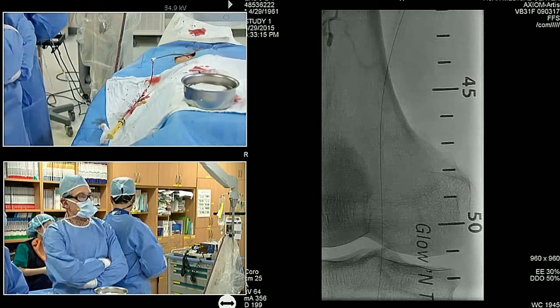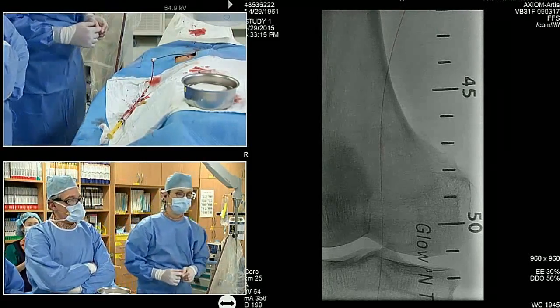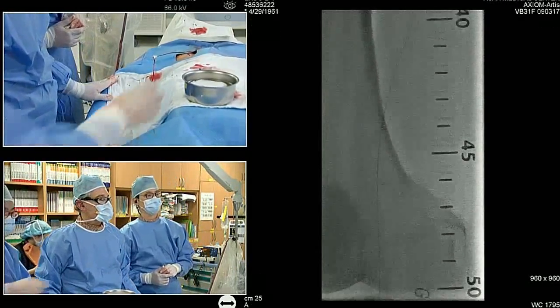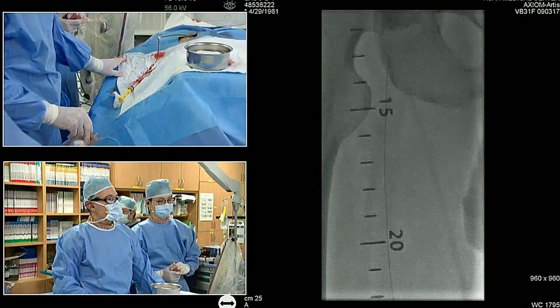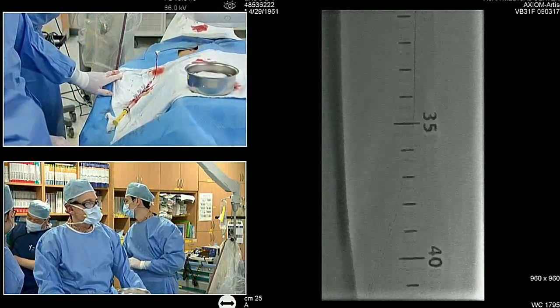I mean, you're at what, 25 centimeters, Bob, or a little bit longer? Yeah, I think so. Our ruler there, our reconstitution is probably at 40 thereabouts, and we start at about 10. So yeah, 30 cm.